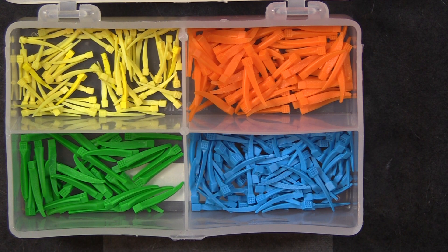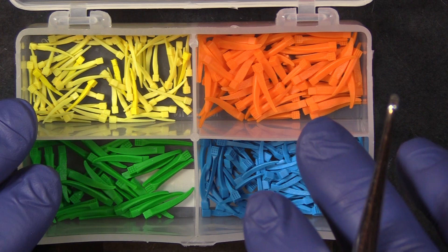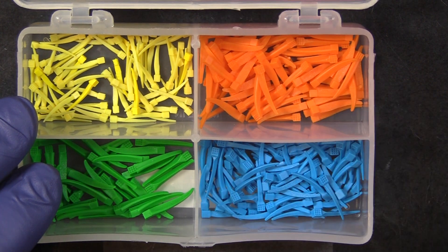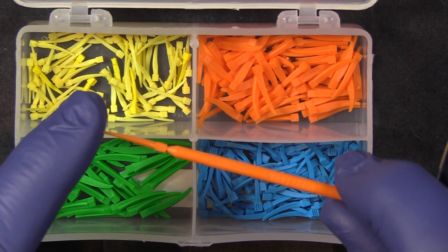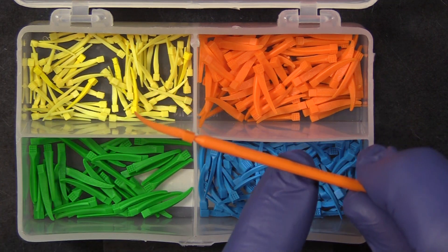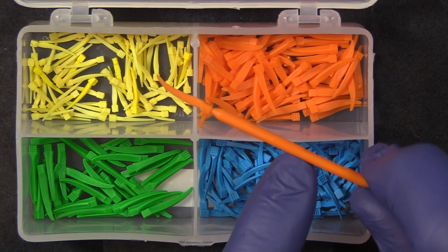Hi everyone, this is Kevin with Garrison Dental Solutions. We're taking a look at G Wedge. The G Wedge product was developed because we have a very popular wedge product called Wedge Wands, but some people don't like the handles on the Wedge Wands.